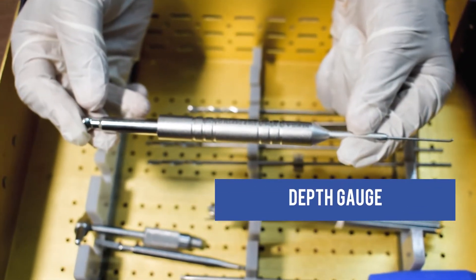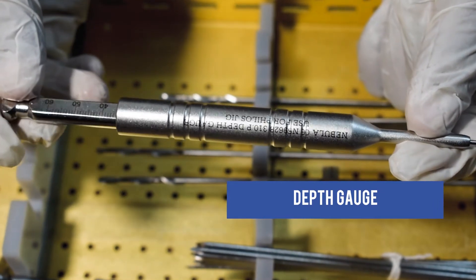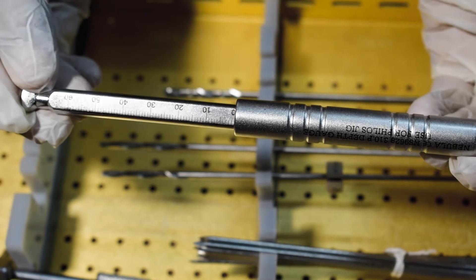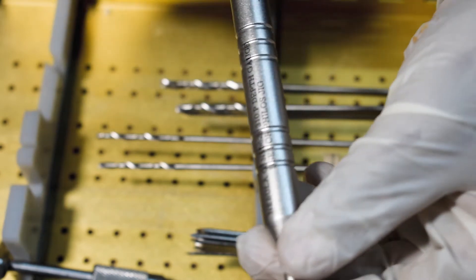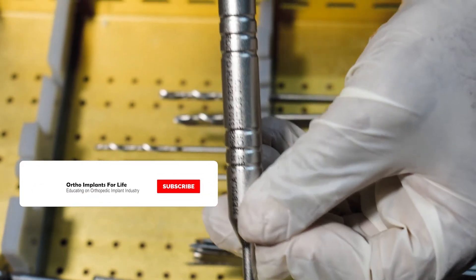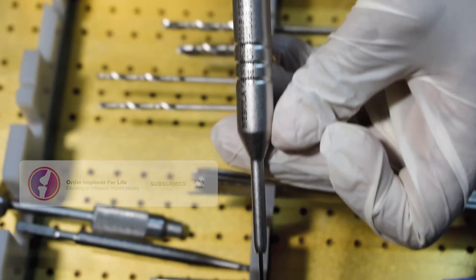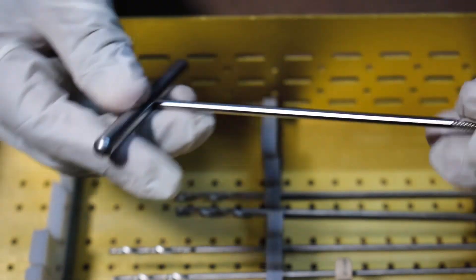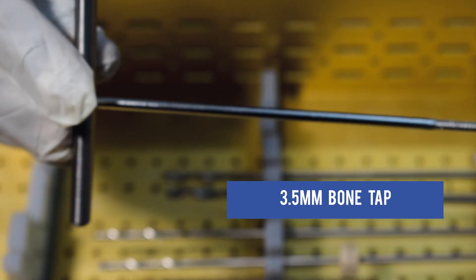This is the Depth Gauge used for the PHILOS Jig. This is the 3.5mm Bone Tap.